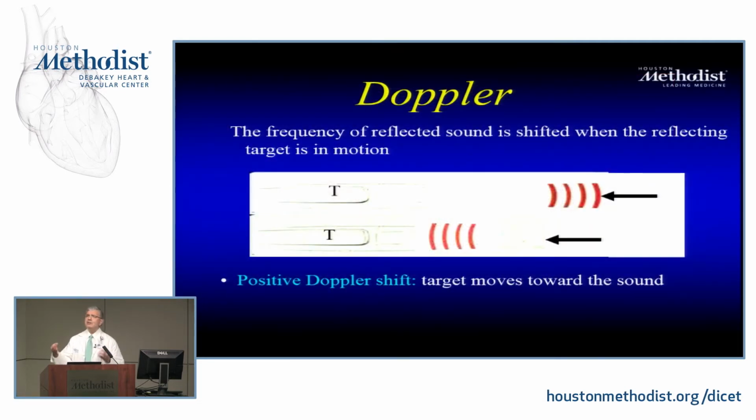So the question then in Doppler is, I sent this fundamental frequency, and if there is a moving object, that's the principle of Doppler, this frequency is shifted. So I sent, let's say, 3 megahertz. If there is a moving object, it's going to change it, but not by a lot. It will change it in the kilohertz, in the audible range. That's why if you're passing by the Echo Lab, you're going to hear it.